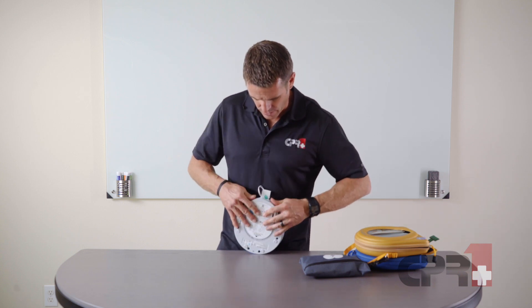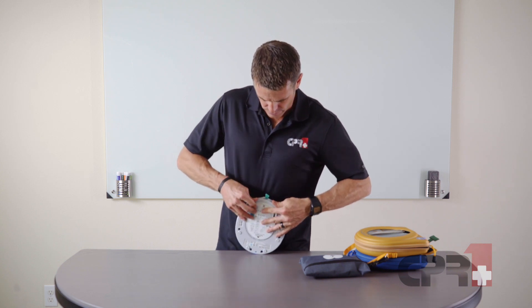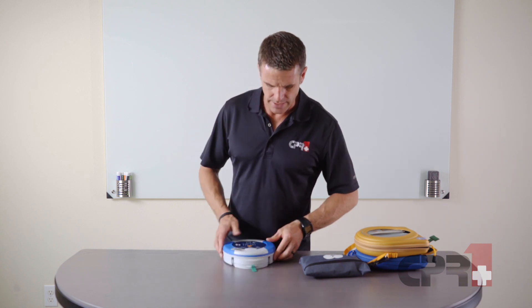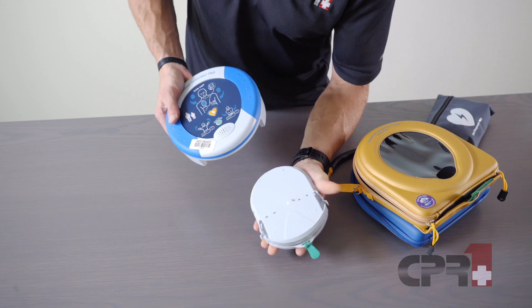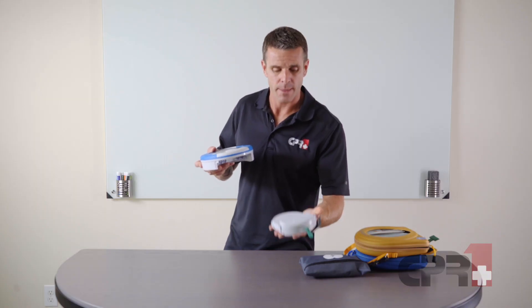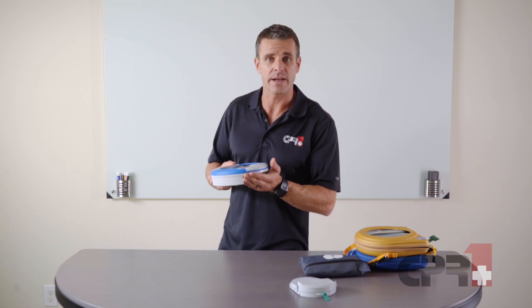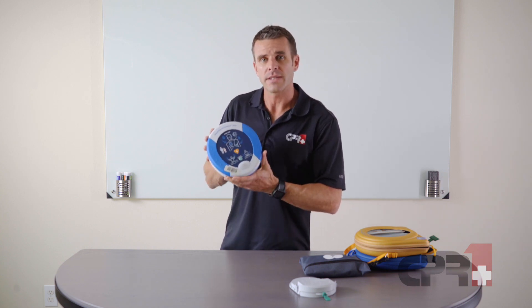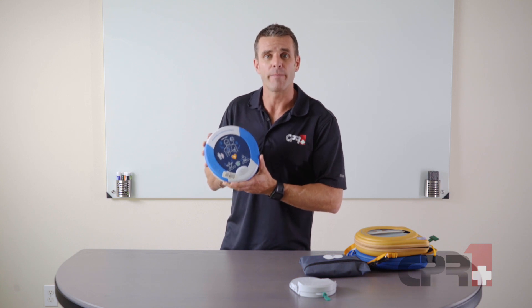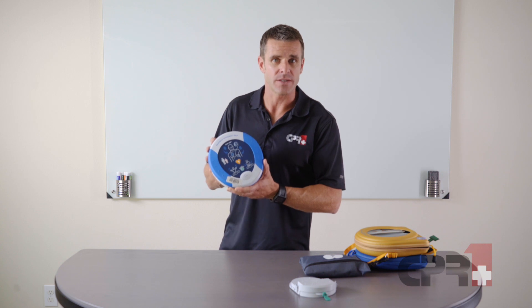When it's time to replace the pads, that's done by these two tabs on the side — we're going to squeeze those two tabs and slide the pad pack out. Then we can take our new pad pack and slide it right into position. Keep in mind with the HeartSign units that the pad packs contain both the pads and the battery, both of which last for four years, so it makes it really convenient.